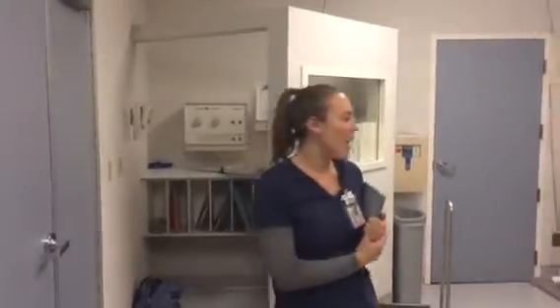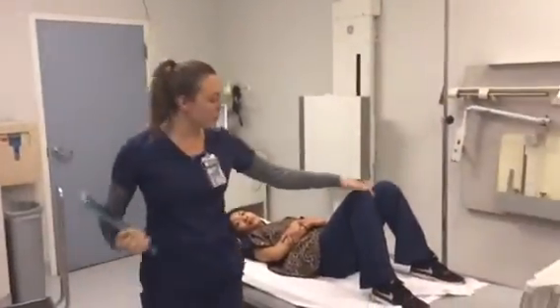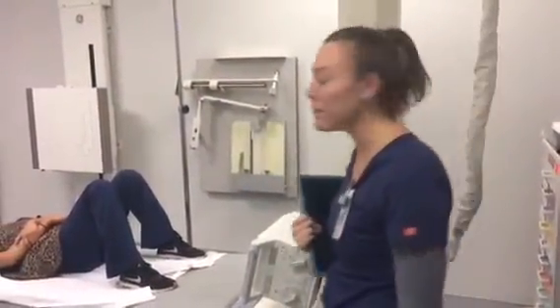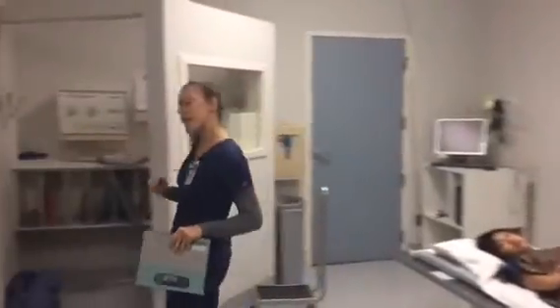All right, so now we're on to our last and final projection. This is the tangential projection of the patella. We have our patient supine and shielded. We've asked them to flex their knee, and we have angled our tube 15 to 20 degrees depending on the flexion of the knee. In this projection, we are going to have our patient help us. So I'm going to turn the lights down here just so we can get a more clear image.